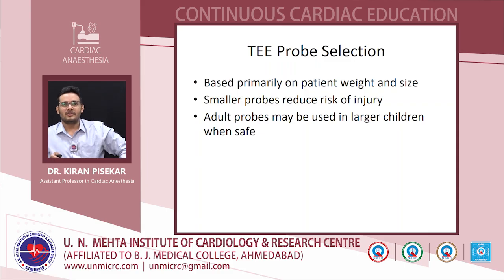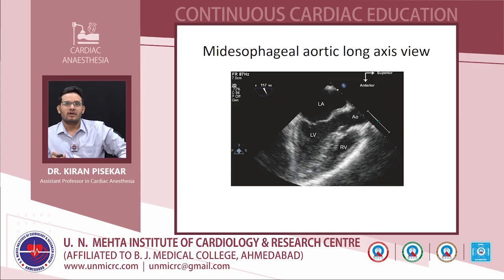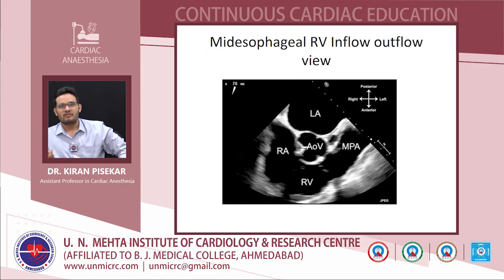No, so as I already told you, it depends upon the weight of the patient, and we'll select the TEE probe. Now the standard view is the mid-esophageal 4-chamber view. This is the mid-esophageal aortic long axis view, and this is an RV inflow-outflow view. On top of that we can use other views like bicaval views and other modified views.